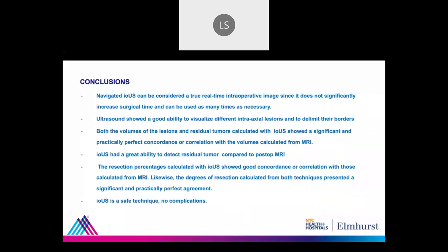And we have to keep in mind that most of the studies compare the ultrasound with the pre-op MRI, a 3 Tesla high quality MRI, not the intra-op MRI, which usually gives us a picture that is not comparable with the pre-op one. And again, it can be considered real-time imaging since it doesn't increase the surgical time, and also we can use it as many times as we want. And that's it.